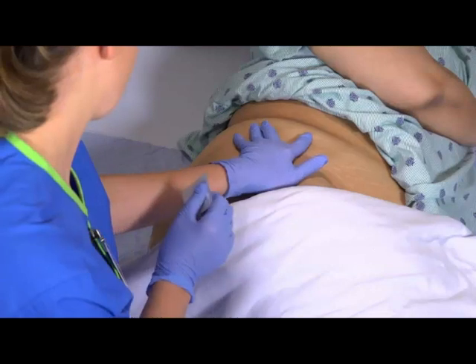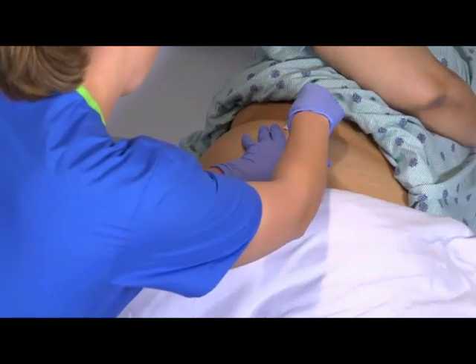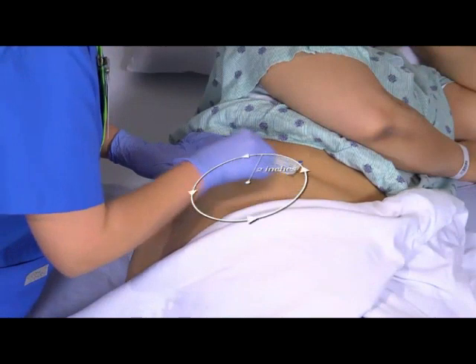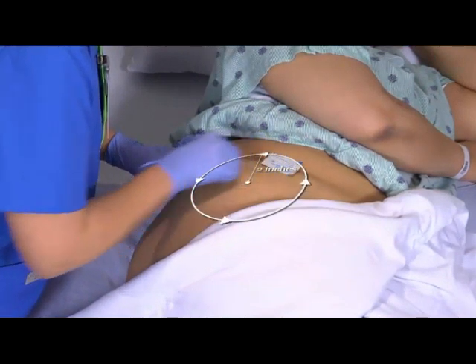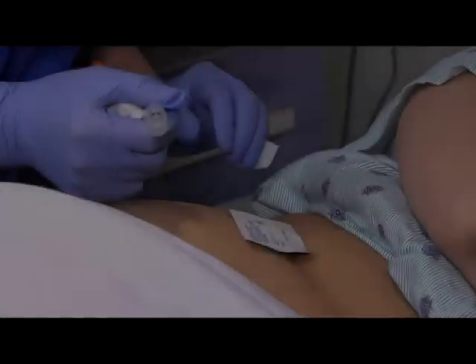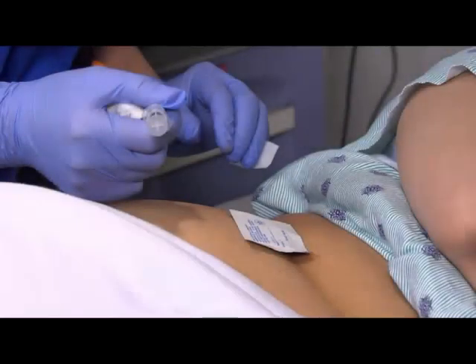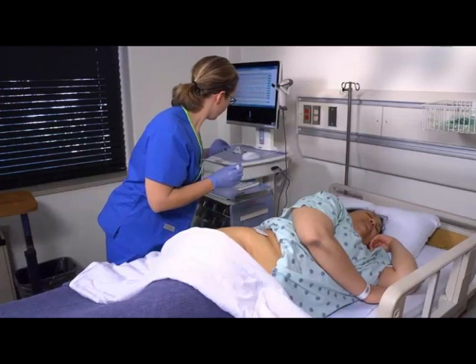Once you have located the site, it may help to mark it with an unopened alcohol wipe. To clean the injection site, begin at the center and move outward at least 5 centimeters or 2 inches in a circular pattern. Hold a gauze pad between the third and fourth fingers of your non-dominant hand and remove the needle cap or sheath by pulling it straight off.